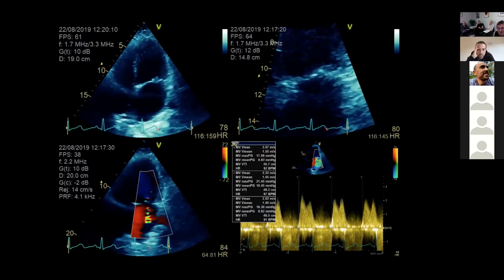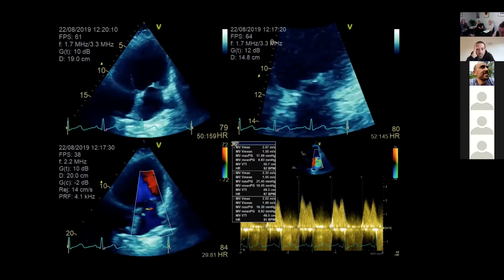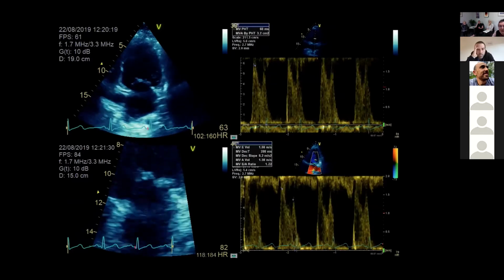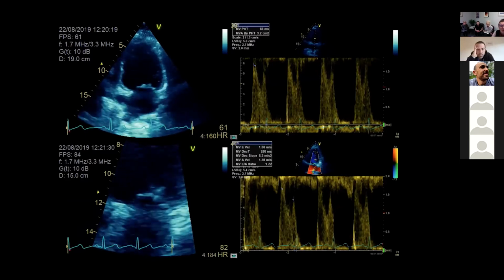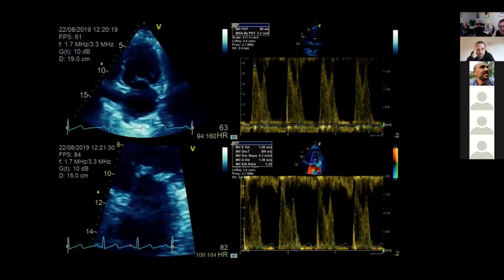No, I agree. You look at that and think this woman is pulmonary, it's got to be pulmonary edema. Well, there's got to be an element of pulmonary edema. Just looking at those pictures alone, obviously we did more. This is just a little closer when we're trying. I don't think this probably adds much more to what you've said already. We're just trying to hone in on that mitral valve a little more. She's 25 weeks.